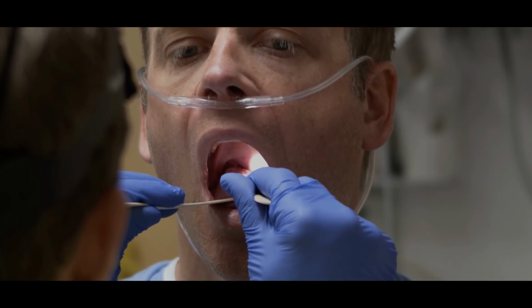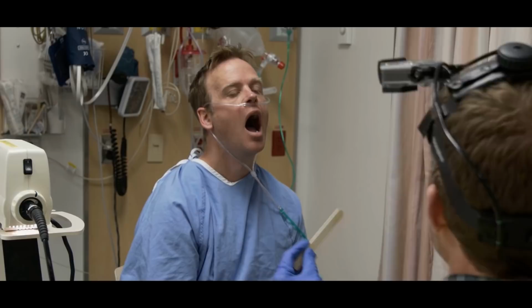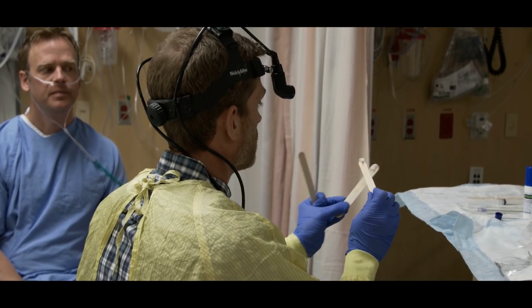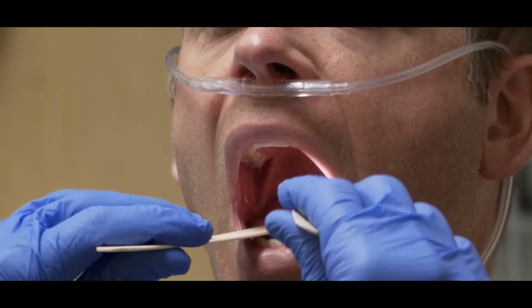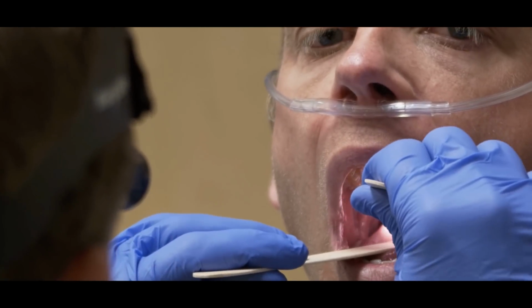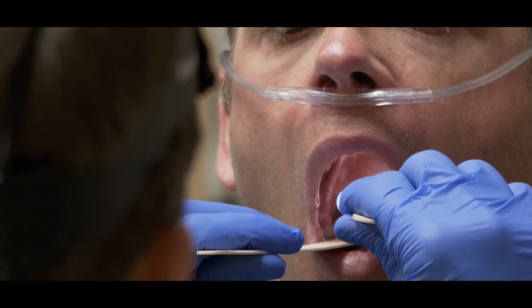And that's it, Chad. You can just continue to breathe, and you can hold that in, and you can even tip your head back a bit, and some of it will drip down into the deeper structures, which is good. That's what we want. And I'm just going to gradually work a little more posteriorly. And once we get around the curve, I'm going to grab some gauze. Okay, little gag there, and that's from the uvula, I think, what I just touched there.